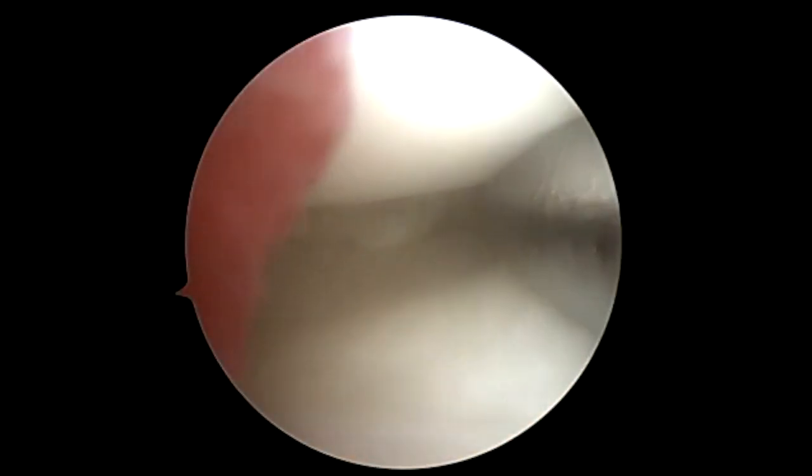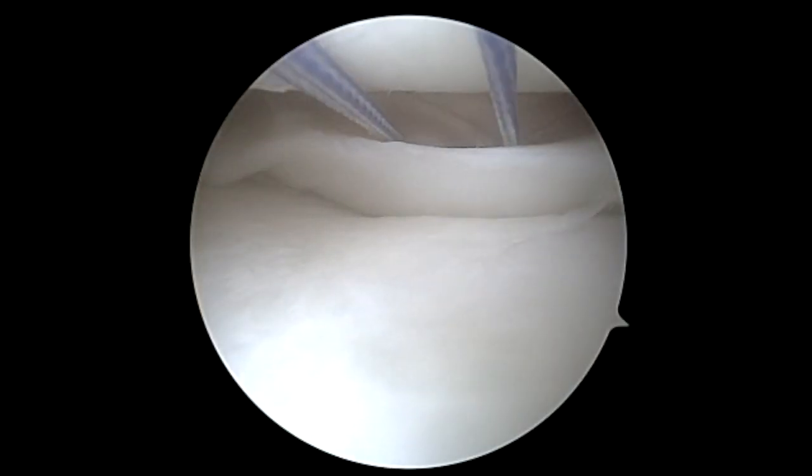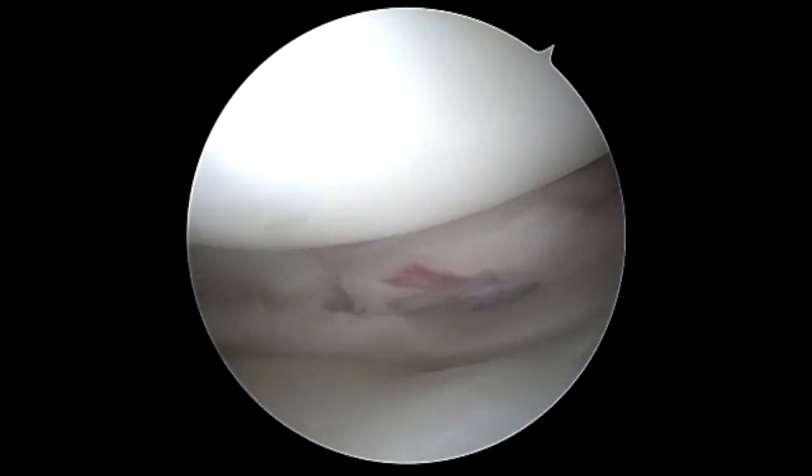That's my probe — we're about to flip the meniscus. We just did; we pushed it back. There's some red inflammatory tissue and fragments floating around, but here you can see we've pushed the meniscus back into the joint. Here is my probe — I've already put one stitch in, and we're checking the meniscus to see where we need to put more stitches. Here we're in the midst of placing one of the sutures using an all-inside technique. This is the final product after the meniscus has been put back into place with multiple stitches — that's the final repair.